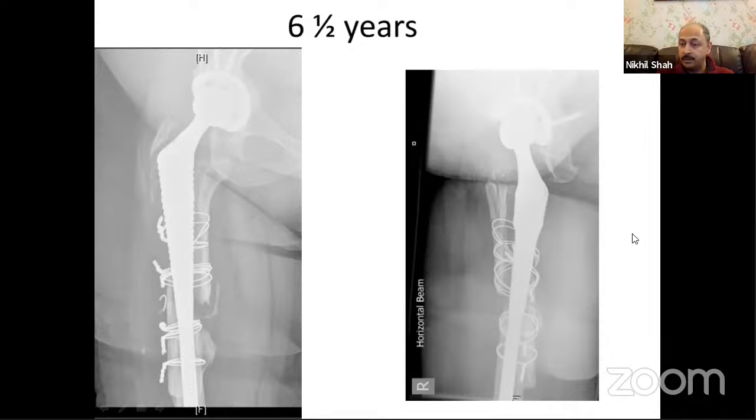I've seen this with a few patients now, where there has been an ETO or a lot of proximal comminution with or without a strut graft, and you use a long stem, the proximal femur slowly starts dissolving. The bone slowly disappears underneath the cerclage wires. I think this is probably a combination of avascularity of the bone and stress shielding. But surprisingly, even though the proximal femur has completely defunctioned, the patient is functioning extremely well at 6.5 years. So that reef stem is now effectively working as a proximal femoral replacement.